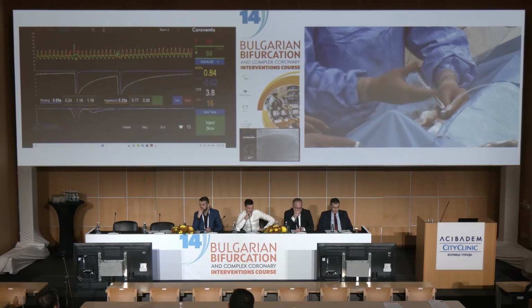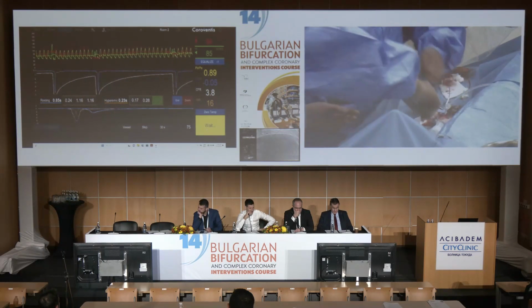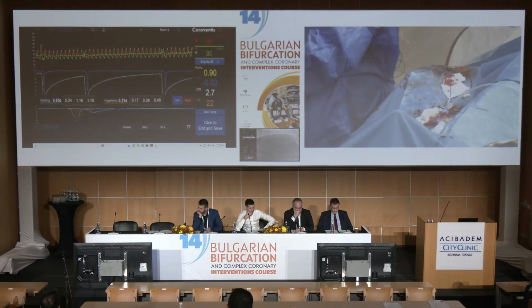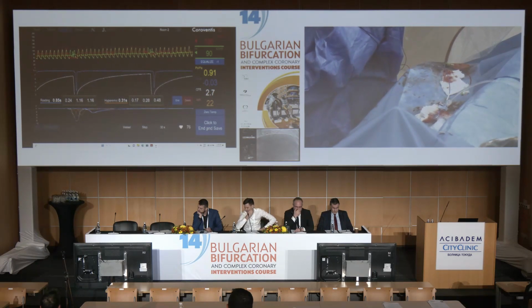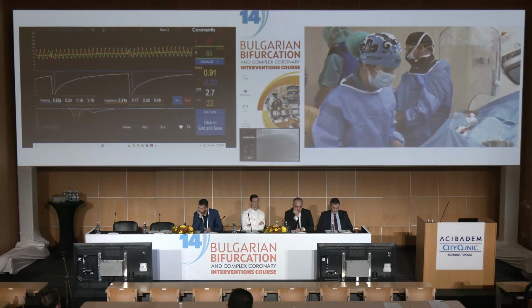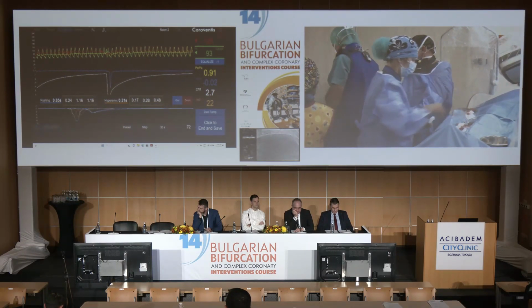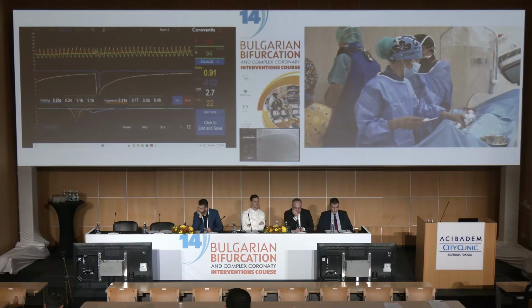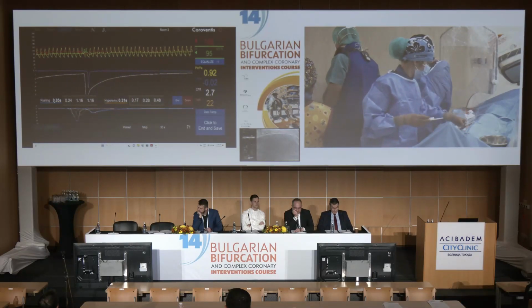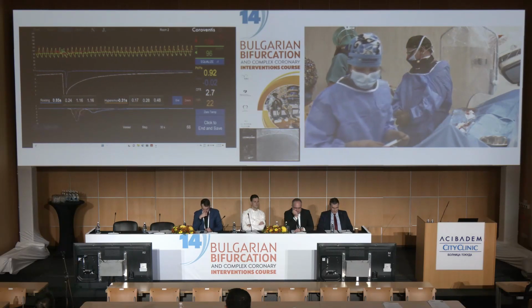Yes? Go? Okay. Let's pause here. For those who have never seen that, it's a little bit difficult to follow, but this goes very fast, and you see that the method is very, very fast. But anyhow, we are here with the mean transit time at rest and the mean transit time during hyperemia.